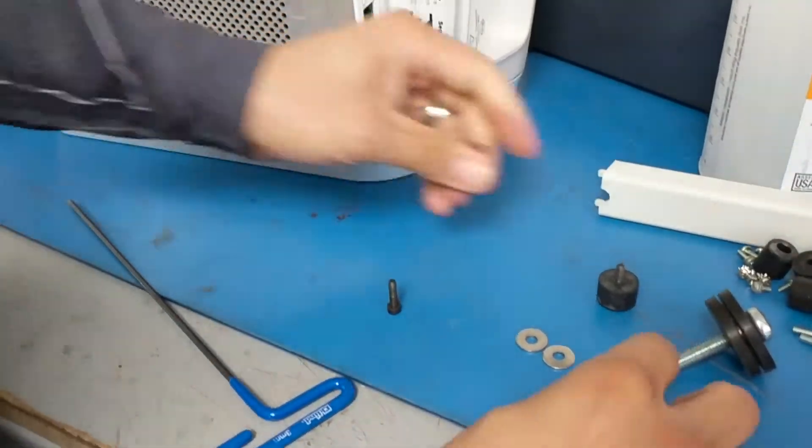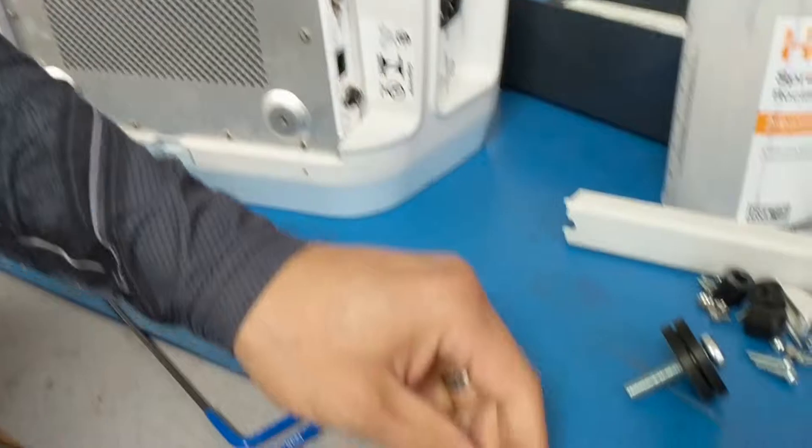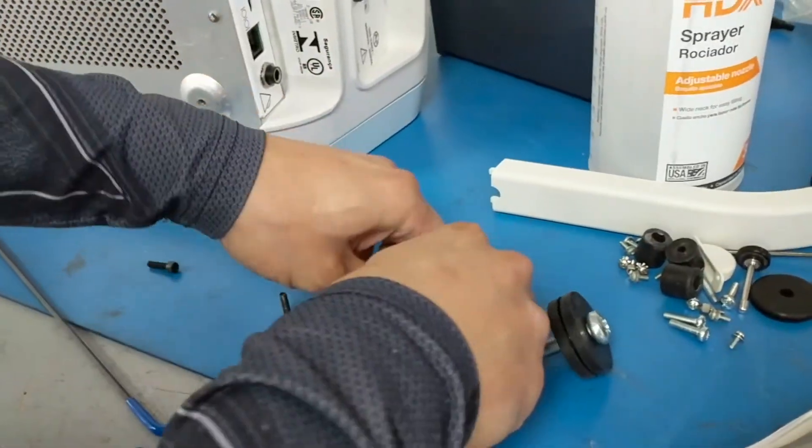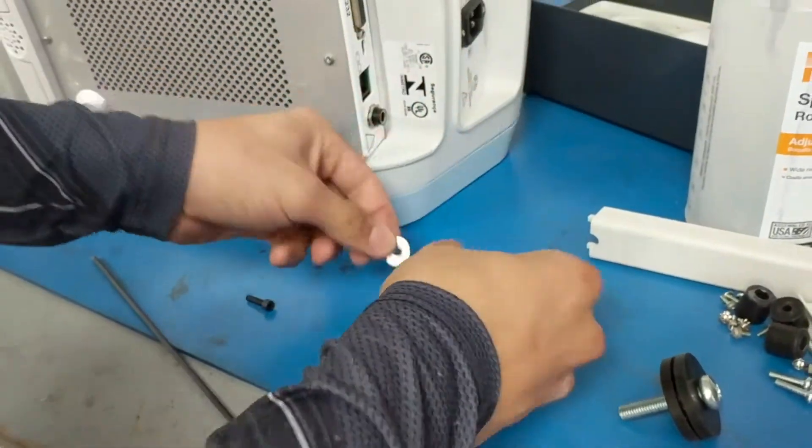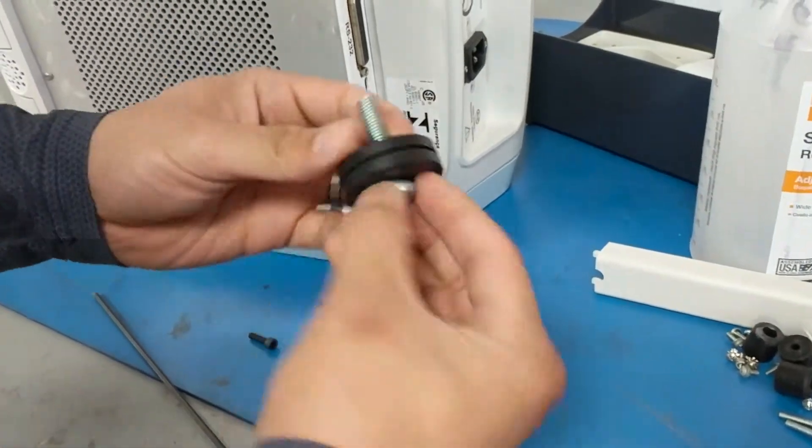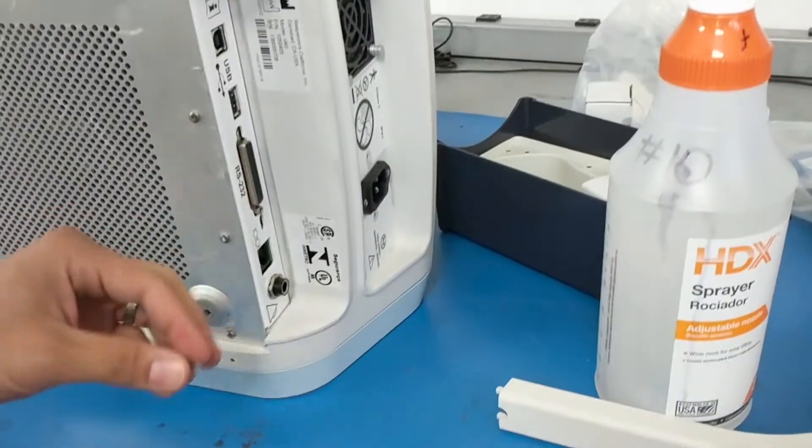Now you will also receive, these are the four we removed, you will receive two washers, right here, and a larger screw, Phillips screw, which is going to go on your cart.